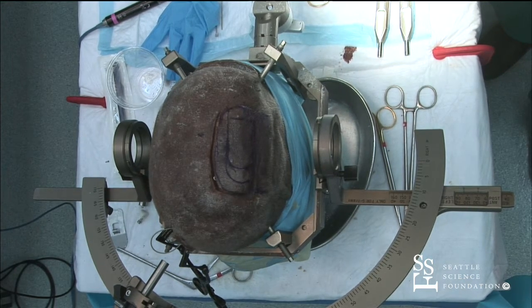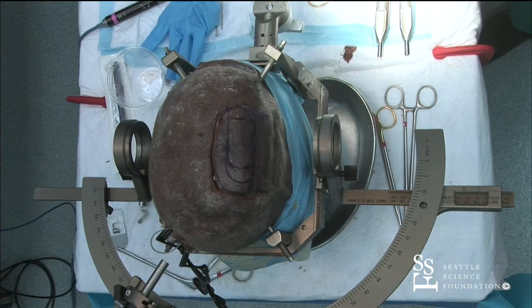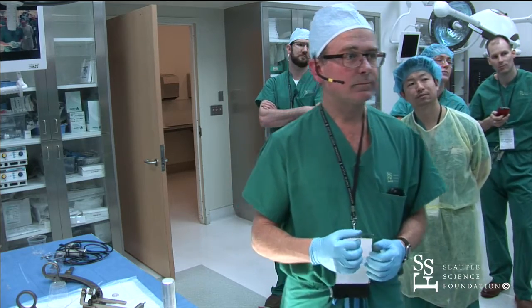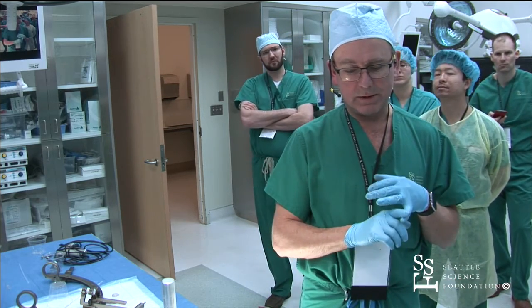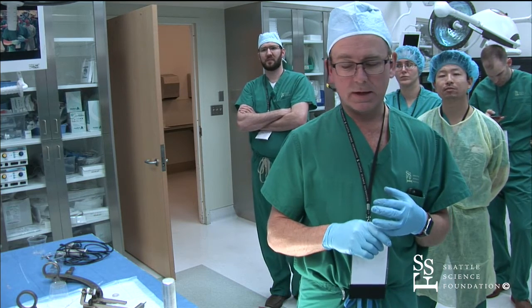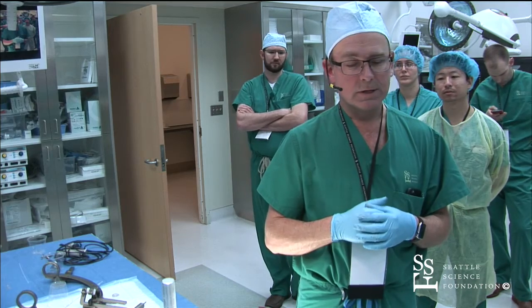The only thing they complain about is that glue is coming out of their hair for like 3 months afterwards. But most people don't mind that as long as there's no infection. Any other question? How often have you changed the battery? Yeah, the battery has lasted anywhere between 1.5 years and maybe 4 years for the RNS. Probably about 3 years is what we're getting out of them now.